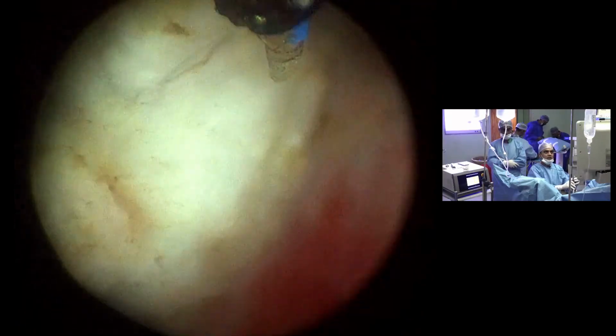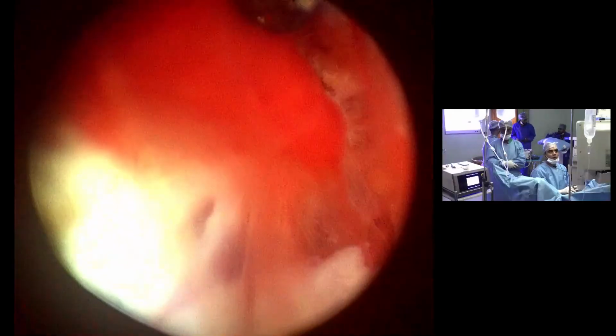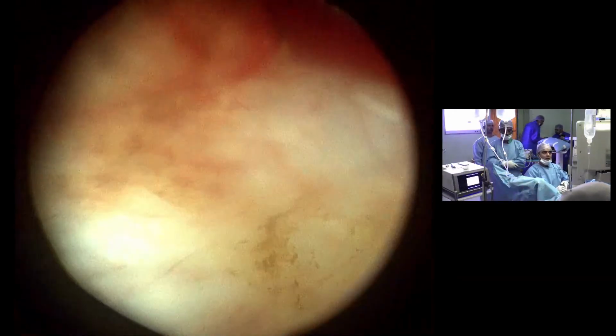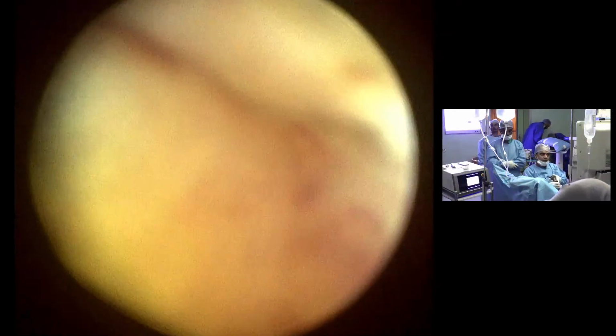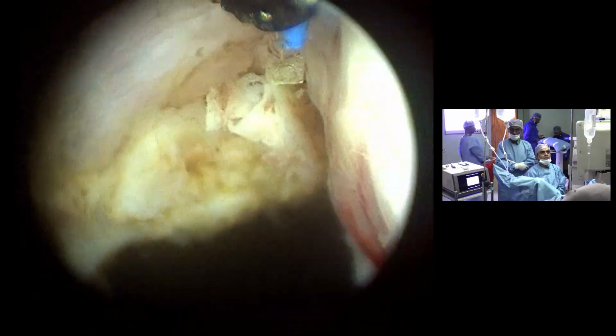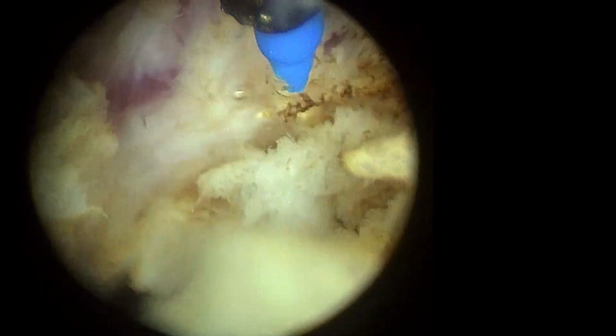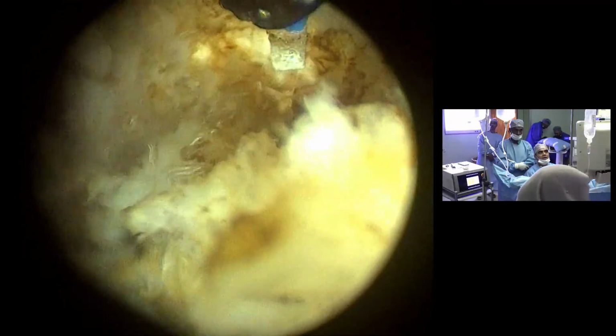The other thing is that the post-op patients have a lot of dysuria. That is a problem always with a green light laser, and that will remain because we are vaporizing only, we are not enucleating. My personal experience is that the patients are not happy per se when a green light is used.